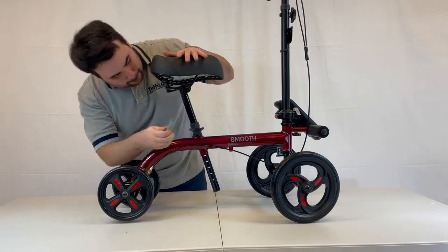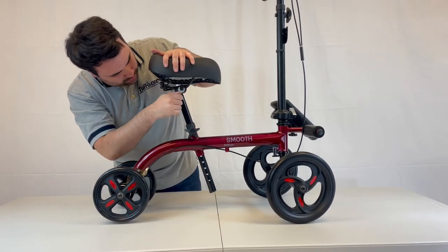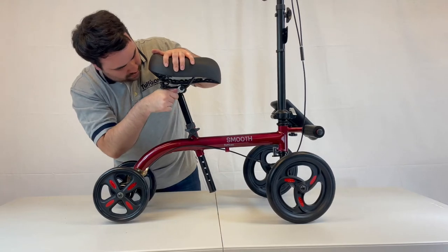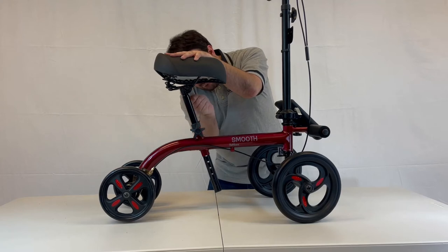Once the seat is mounted, readjust it to the desired angle. Again, it is very important to tighten the nuts on both sides of the seat equally. Failure to do so will cause the seat to spin.